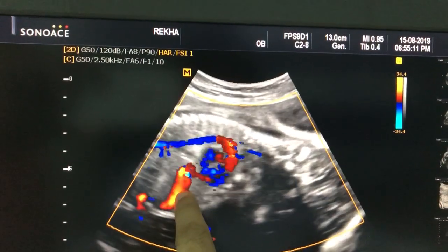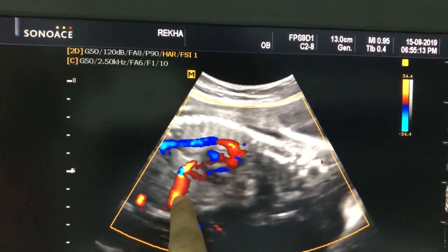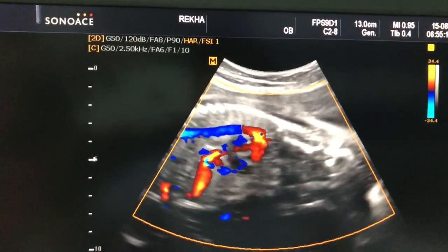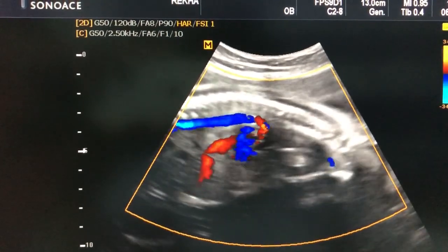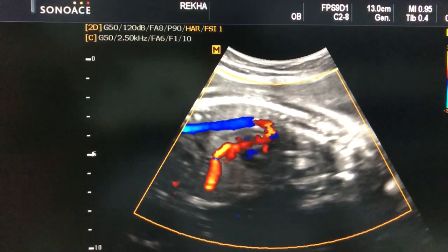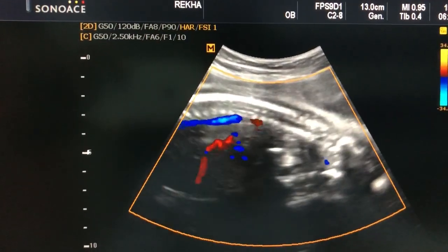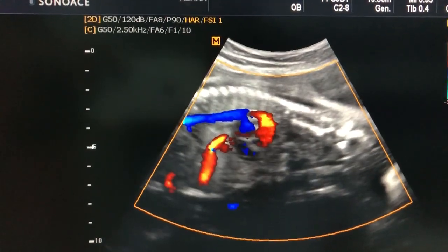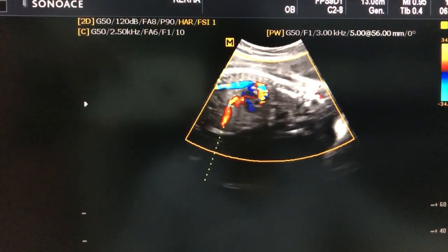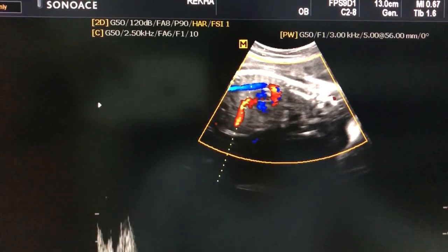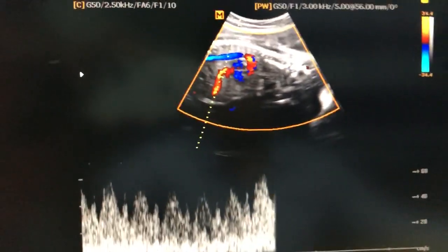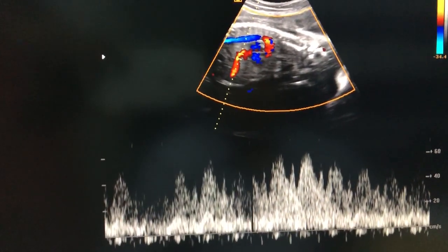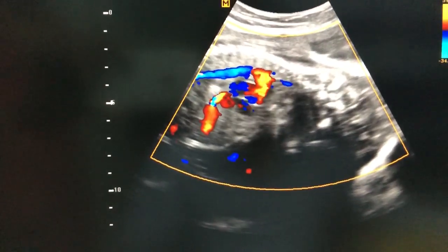This is the portal vein, and here you have to look for the aliasing at the velocity of 34. Wherever you see aliasing, you have to put the color flow and check. Yes, here we get the ductus flow once again.